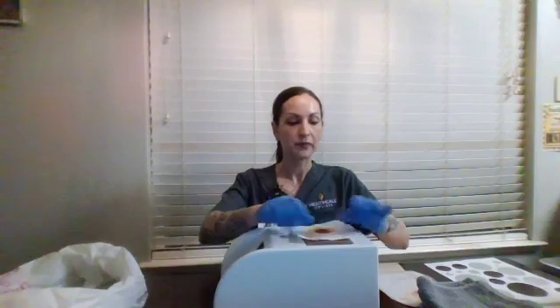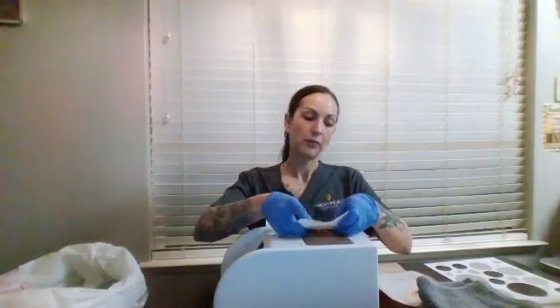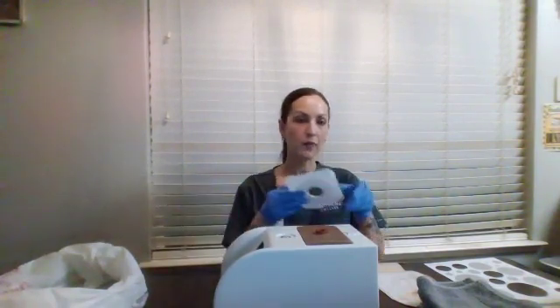Now, second, we're going to be removing the face plate ring — remove it gently by going towards the skin of the stoma, and then you would toss this into the garbage. Again, I'm going to set this to the left of me and use this as my new face plate.